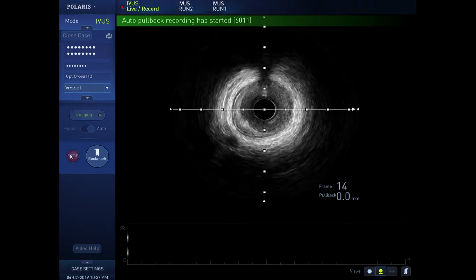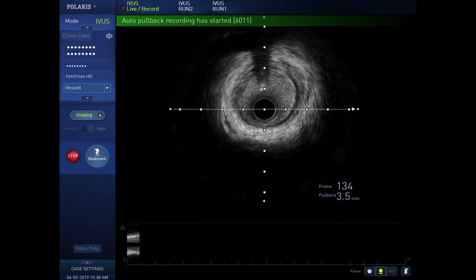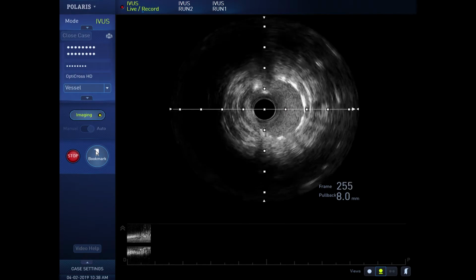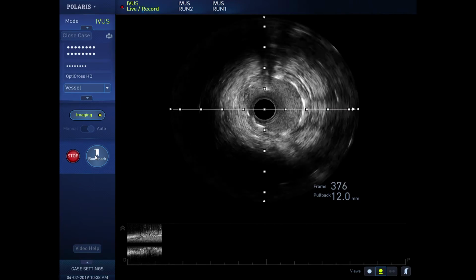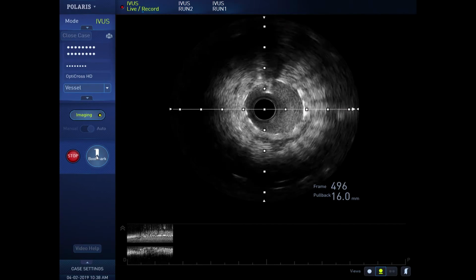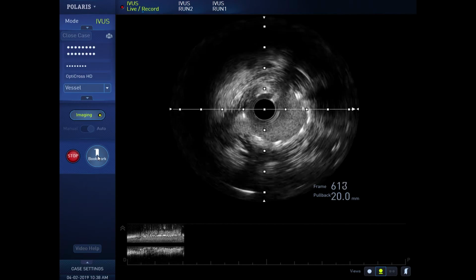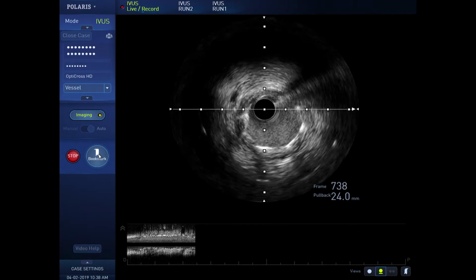Stenting. Pulling back. What they're doing now is putting the intravascular ultrasound back in at the distal edge. No dissection. You start to see the stent. You see the demarcation of the stent? That was a beautiful transition from the distal to the proximal vessel. That lumen, remember, was here. Now it's been pushed back against the vessel wall with a really good adherent, well-expanded stent.